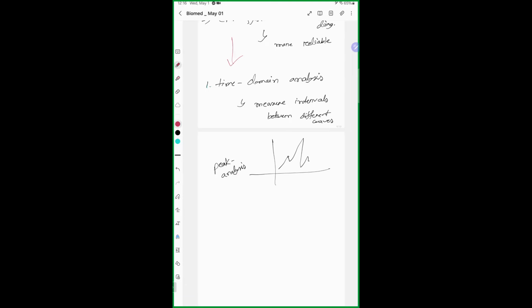No sir, we haven't. Okay. So in peak analysis, you try to identify the peaks of the signal. Let me show you one.